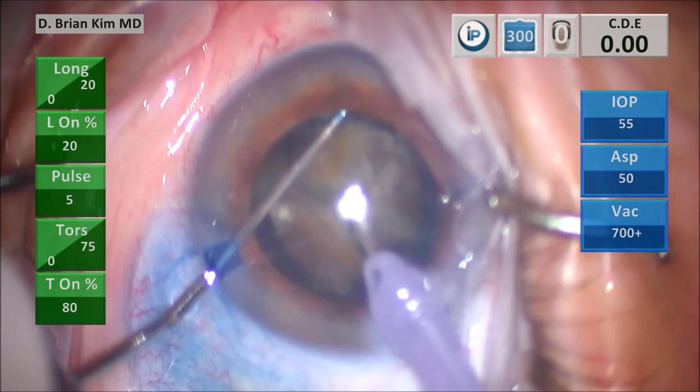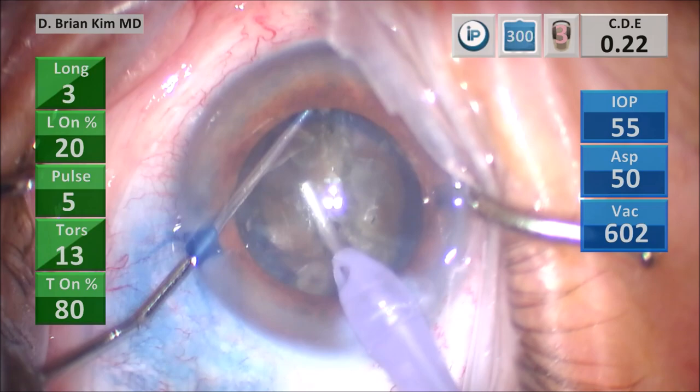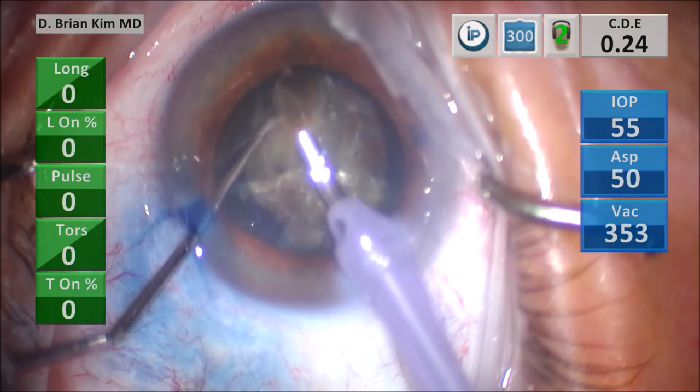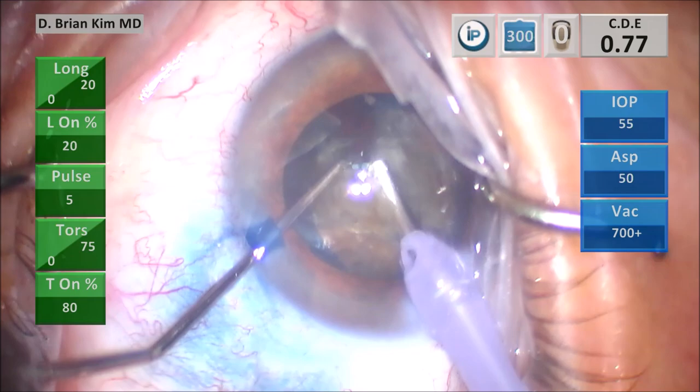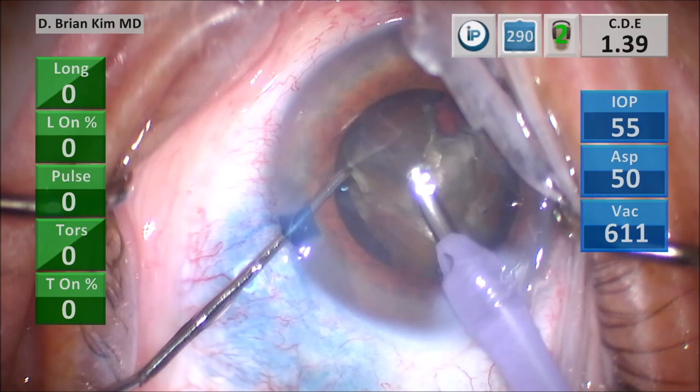If you pay attention, when I did the double chop, I caused a little piece of the capsule sub-incisionally to be removed. There's a semicircular defect in the sub-incisional capsule, and I actually caused an anterior capsule tear, but it ended up being a semicircular tear. Very carefully, I use vacuum to pull the piece up and then use the chopper to get around it, and then I'm sandwiching the lens pieces.